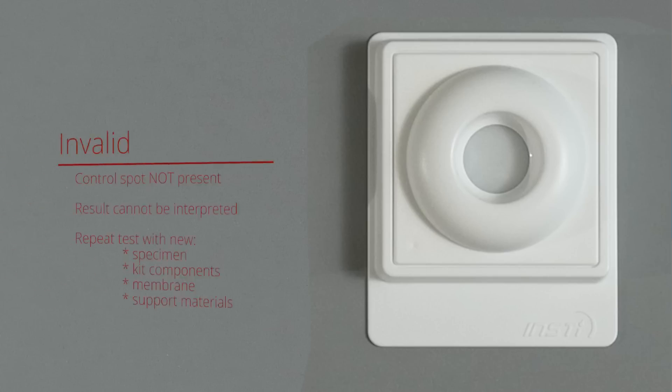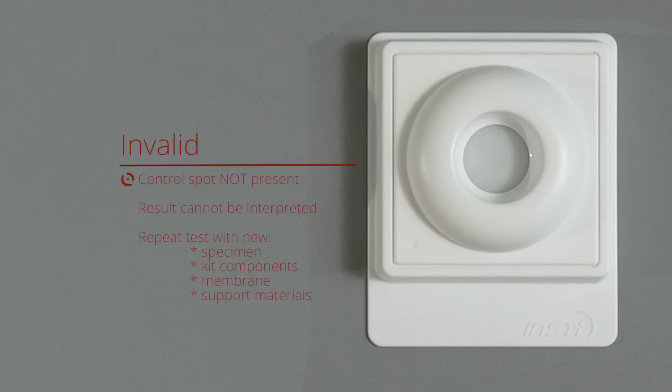Invalid result: the test is invalid if there is no control spot on the membrane. An invalid test result means that the test was run incorrectly or insufficient specimen was added. Invalid test results cannot be interpreted. Any invalid test should be repeated with a fresh specimen using a new membrane unit, kit components, and support materials.